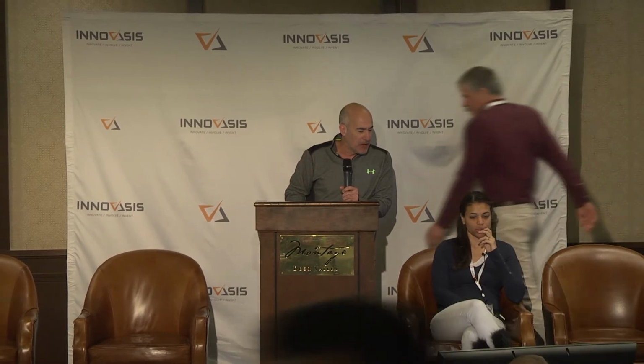But with that said, very quickly, as we're getting up, this is a typical case that we all see in practice. 65-year-old female, progression of her back pain and new onset bilateral L5 radiculopathy. You can see pretty high-grade spondylolisthesis with collapse at what we're going to call the L5S1 segment, the lowest motion segment. You can see with flexion extension, she does move a little bit, but really her disease is facet-based. So if you look at her parasagittal, she has severe foraminal stenosis, and she's got facet arthropathy, synovitis. So this is certainly a case that I think many of us in the room would say a posteriorly based procedure is a good procedure.